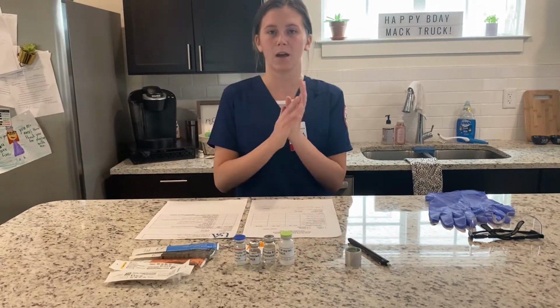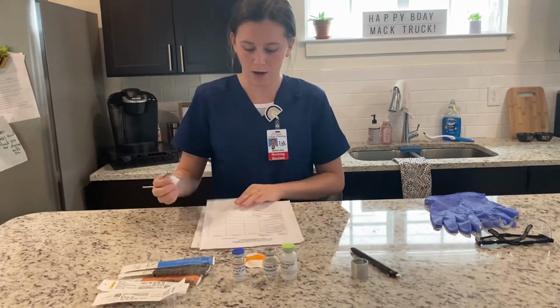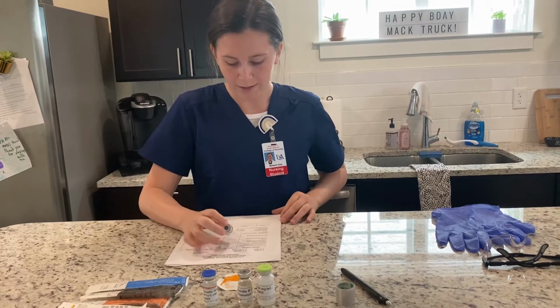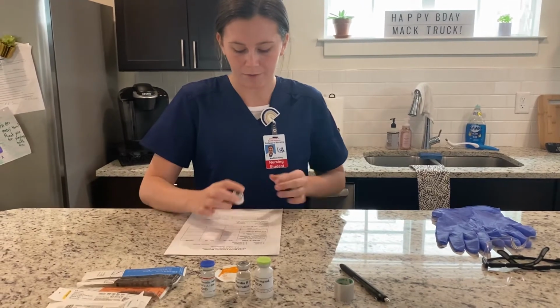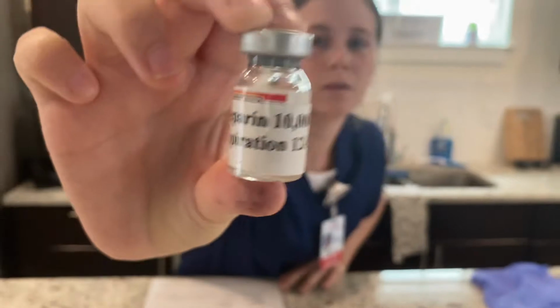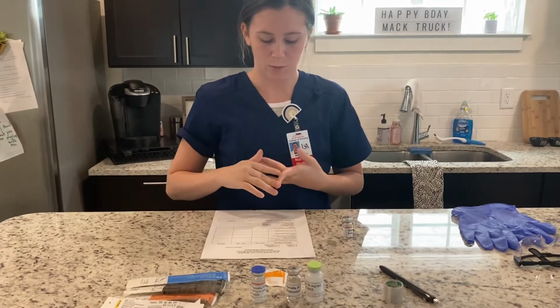So now I'm going to begin by performing hand hygiene, and then I'm going to get my vial and compare it to the MAR to make sure I have the right vial. So I have heparin, 10,000 units per milliliter, and the expiration date is 12/5/2025. So I'm going to show that to you. I'm going to make sure I have the right time now. It is given every 12 hours, and it has not been given in the past 12 hours.